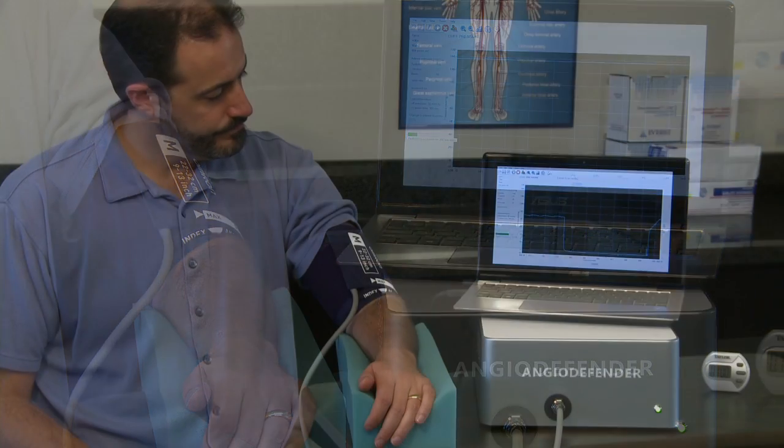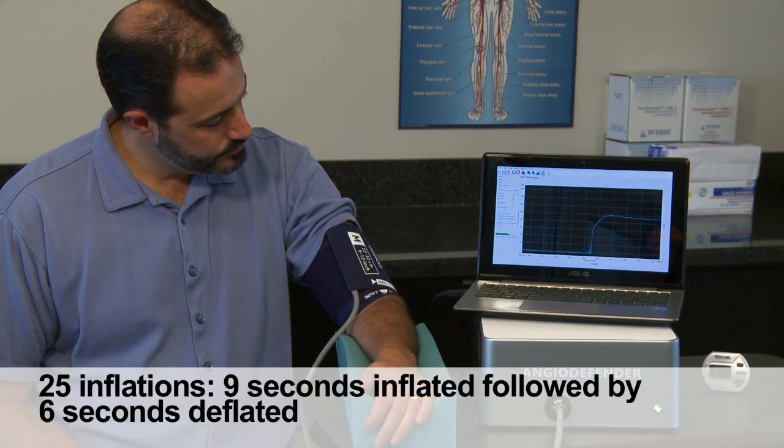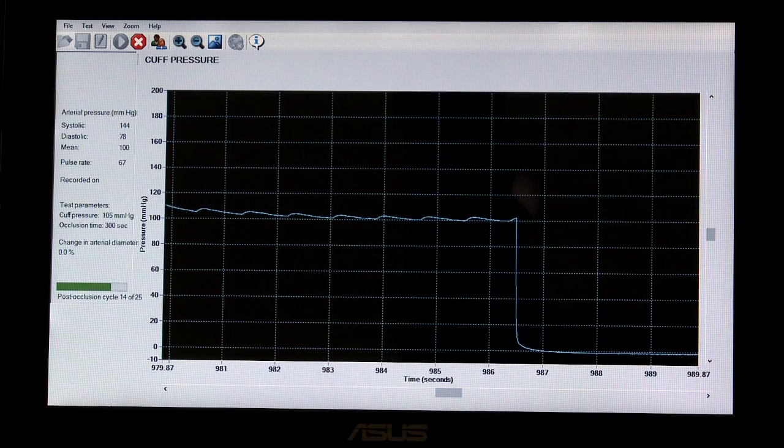Approximately 30 seconds after the cuff deflates, the system begins a sequence of 25 non-occlusive pulse wave measurement cycles using the same pressure and sequencing as used prior to the 5 minute occlusion.